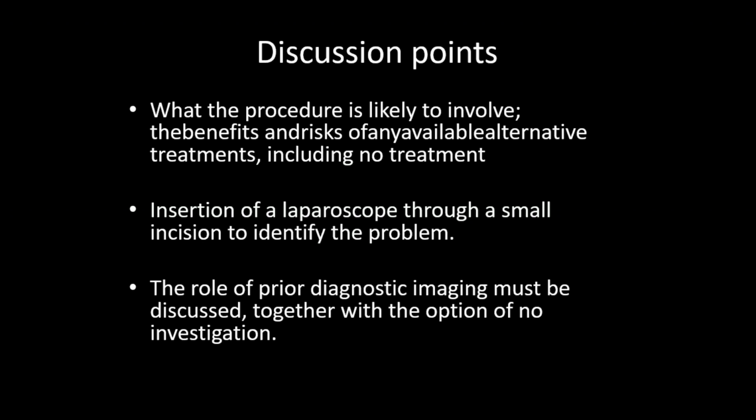The only thing you can do is insert a secondary port, and put the camera from the second port to look at the primary port. I mean vice versa: not the primary one looking for the secondary one, but you see the primary port through the secondary one.